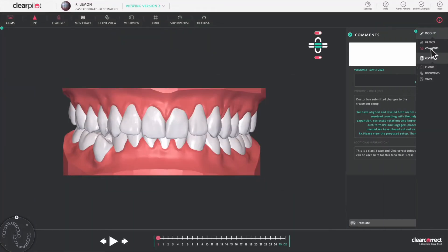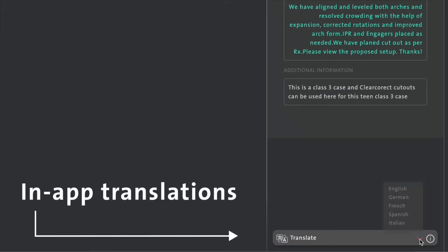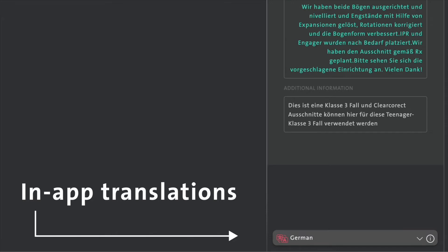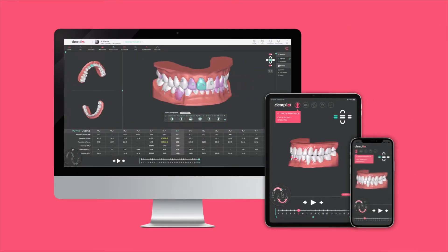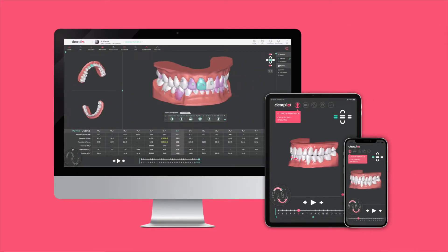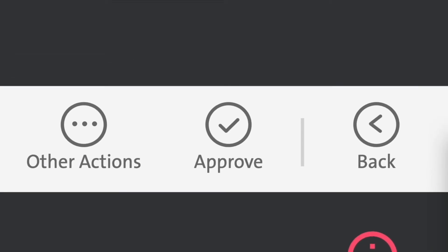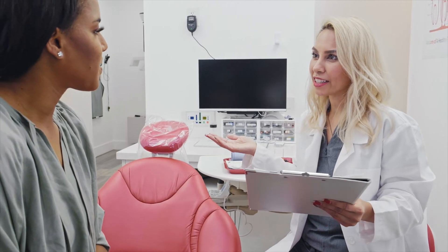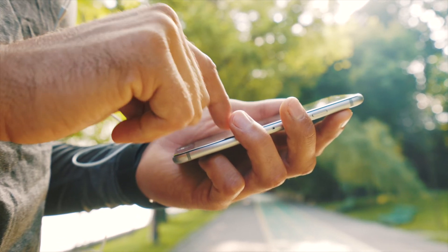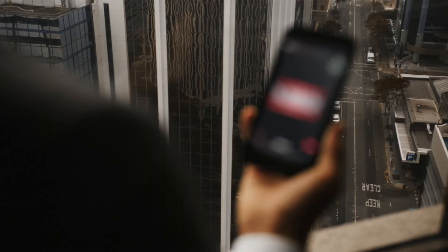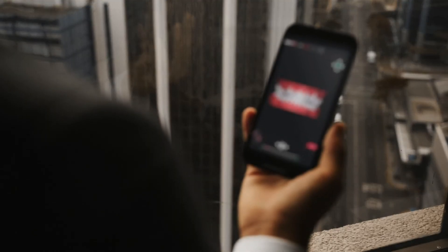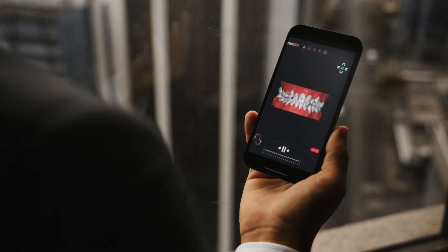ClearPilot was built with flexibility in mind. That's why our intuitive web-based platform gives you the ability to review and approve treatment setups anywhere, anytime — whether at the office, at home, or on the go. You can even share your setups with your patient remotely to help drive conversion and engagement.